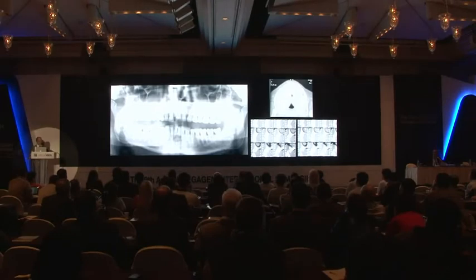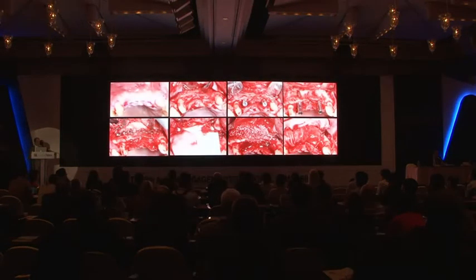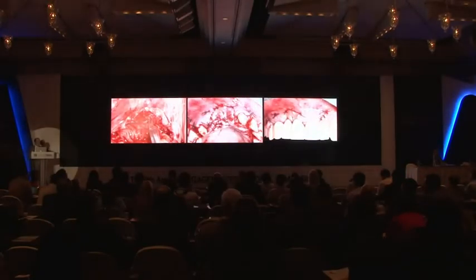In this patient, we extracted the upper first and second incisors and included canine. After 6 weeks from the extraction, we inserted the implant, with an important bone defect. In this case, we used a bone tissue augmentation with the osteosynthesis plates and a double resorbable membrane fixed with pins. Periosteoplastic flap for a better closure.